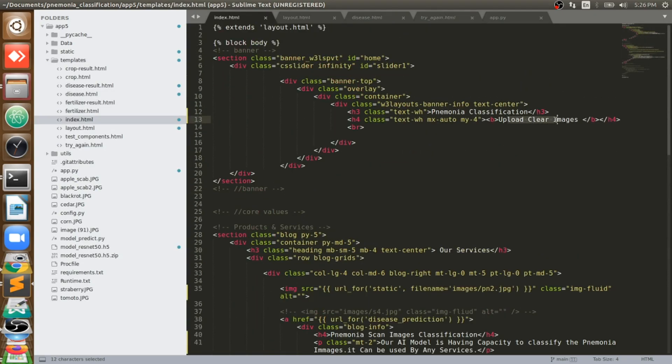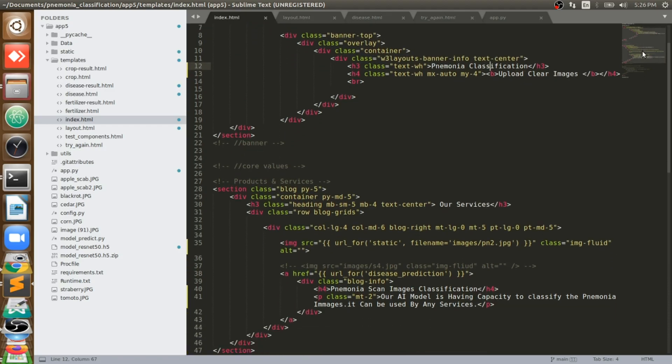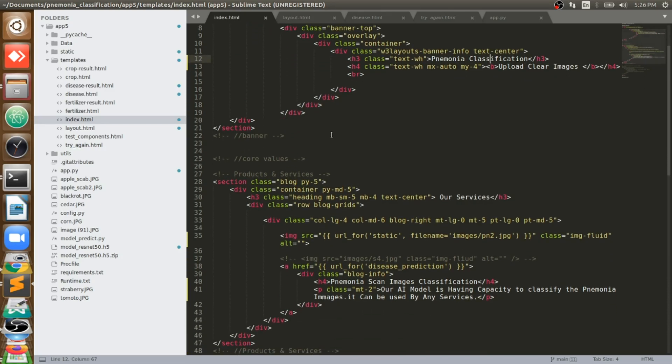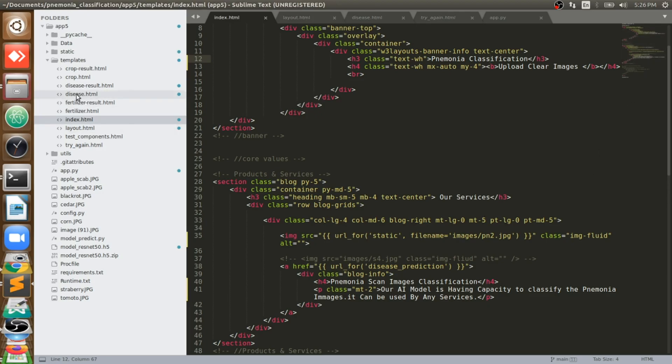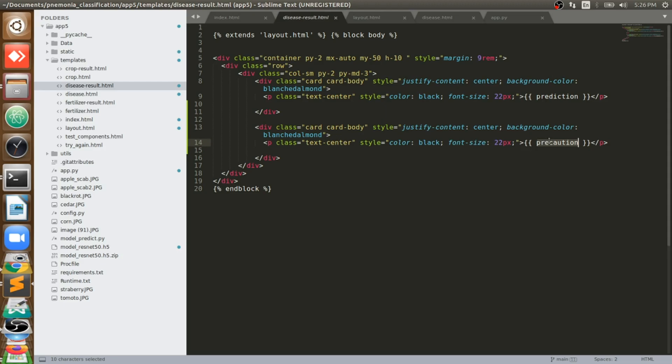That you can see here, we have an HTML page, index.html. This is an index page where it asks for upload. Once you upload, that data will be sent to the app.py, that is Flask API. Their processing will happen, prediction will be done, and the result will be given. That result will display in result.html.